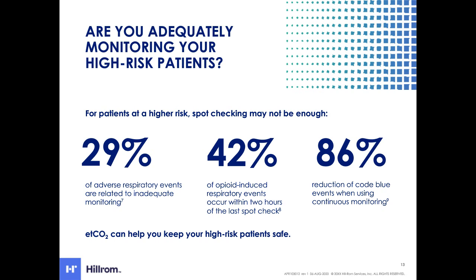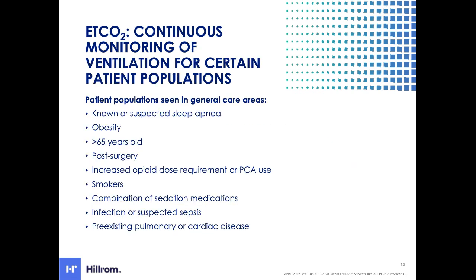Patients with risk factors such as pre-existing pulmonary or cardiac conditions, post-surgical patients who may be on opioids for pain management, or those who are elderly or obese may be considered higher risk. But which of these patients requires continuous end-tidal CO2 monitoring?